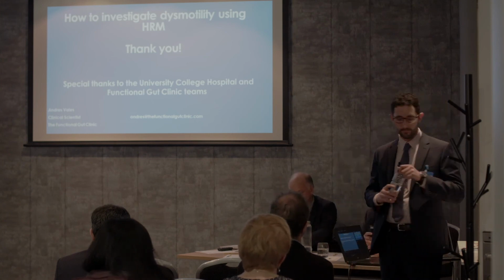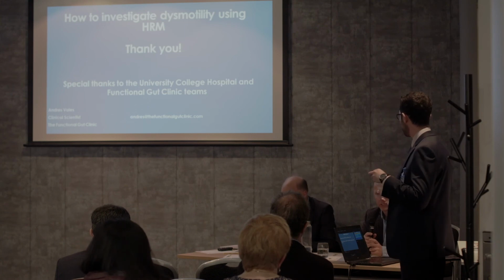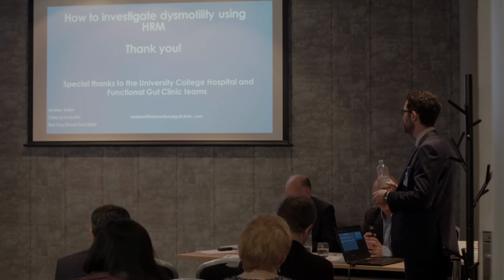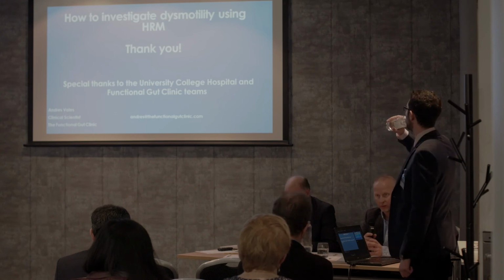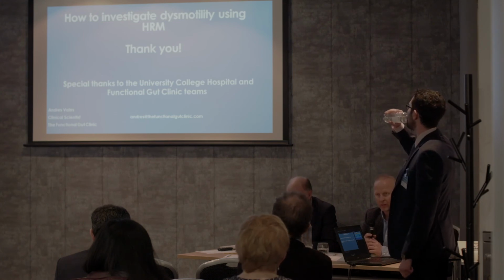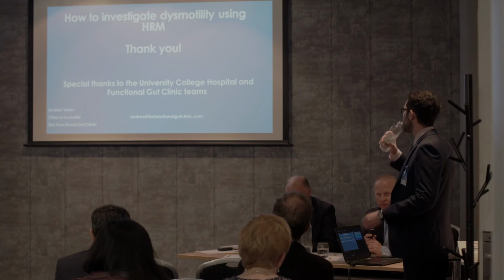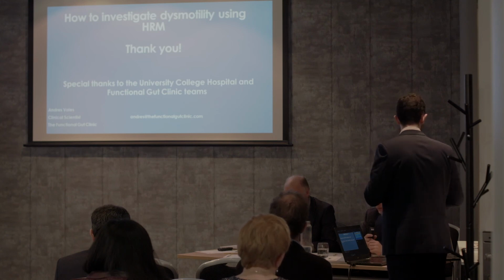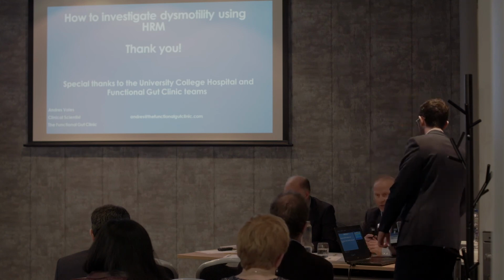Another thing to remember about the IRP is the equipment that you're using. If you use an MMS, or if you're using Sierra, the catheters all have different cut-off values. So just bear that in mind and make sure you're reporting it in terms of the right equipment that you're using. And I think a few of those little things should help a great deal.